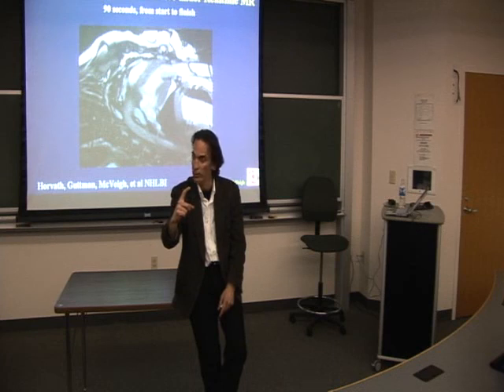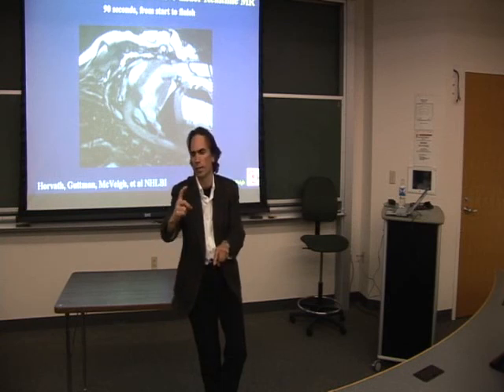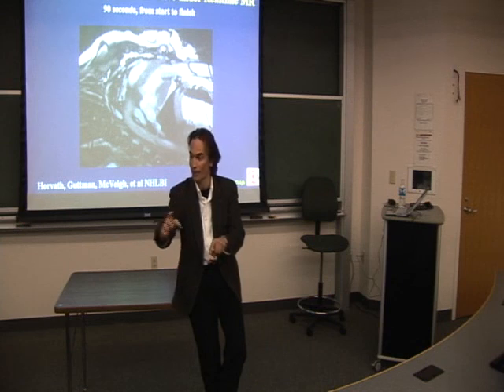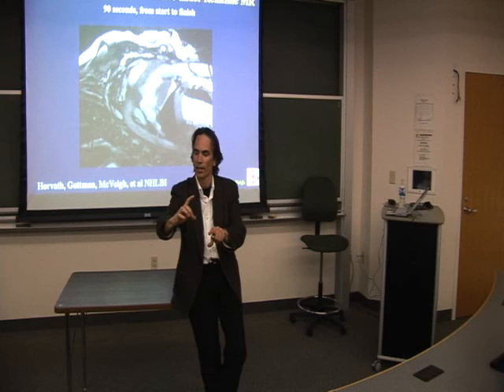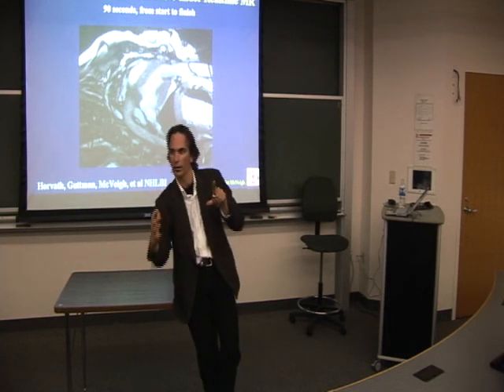Go, oh, there it is. And that's a projection, and we can do that with a button press. And when Mike has the projection tool on, the other cool thing that he's done is if you then take the 3D view and rotate it, you take the gradients and rotate them. So you look with the scanner from different angles.